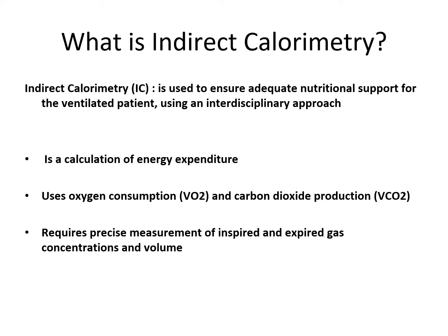This technique is based on the theory that all energy a person uses is derived from the oxidation of carbohydrates, fats, and proteins. The ratio of CO2 produced to O2 consumed is your respiratory quotient. So VCO2 over VO2 equals RQ.